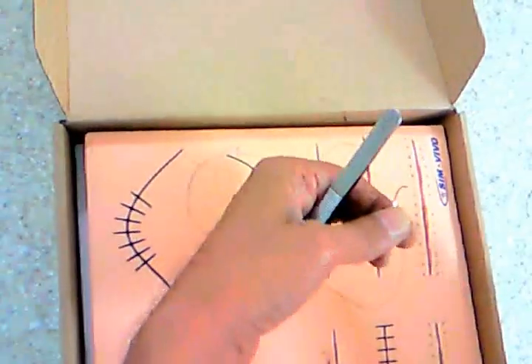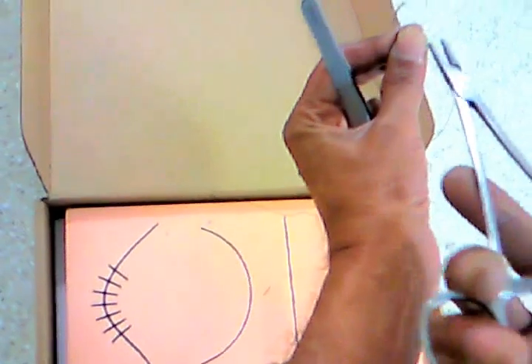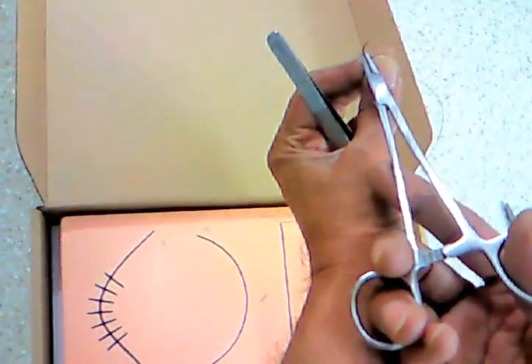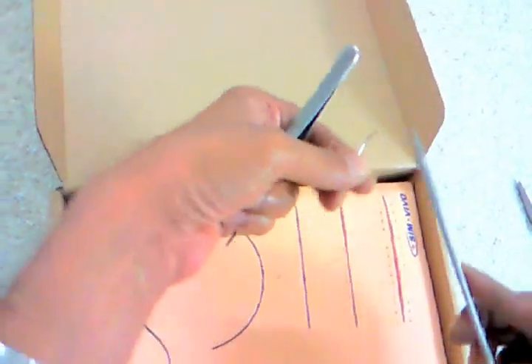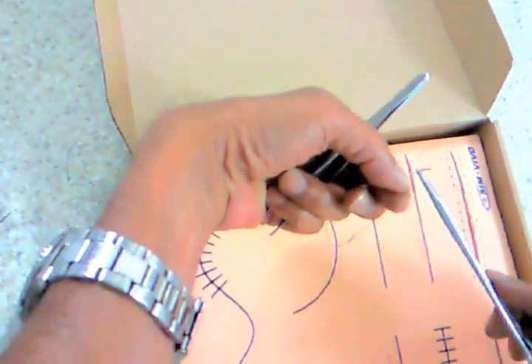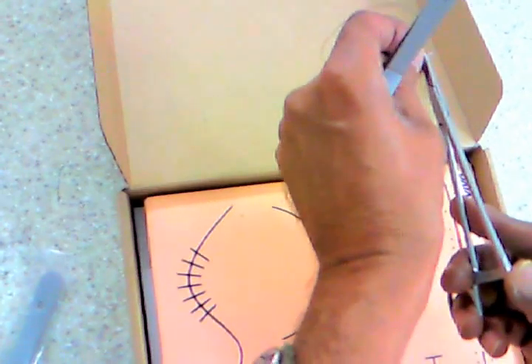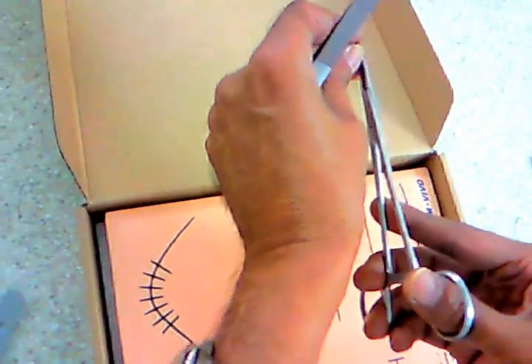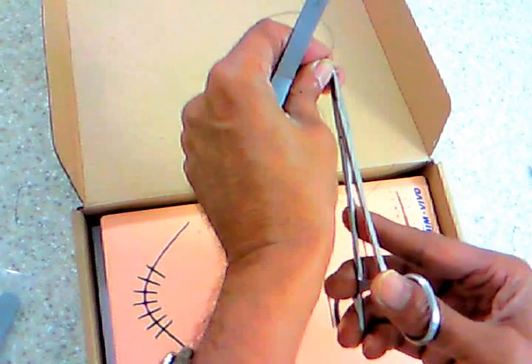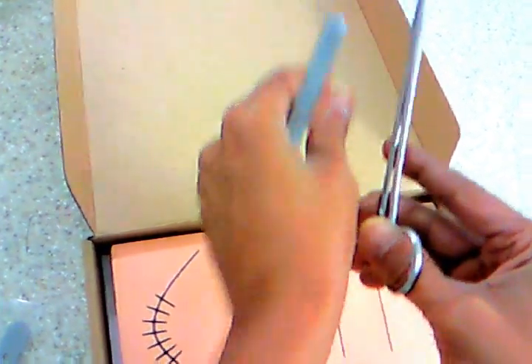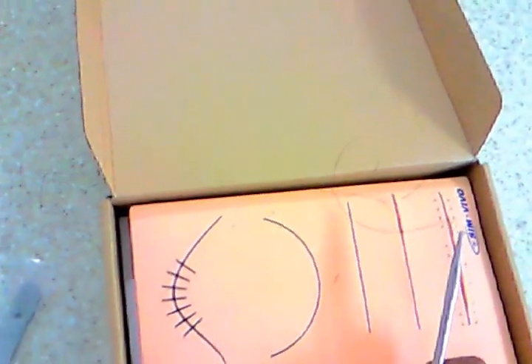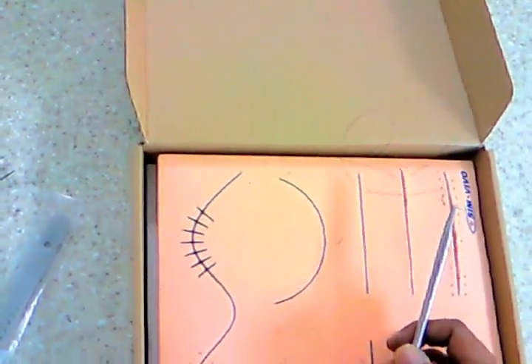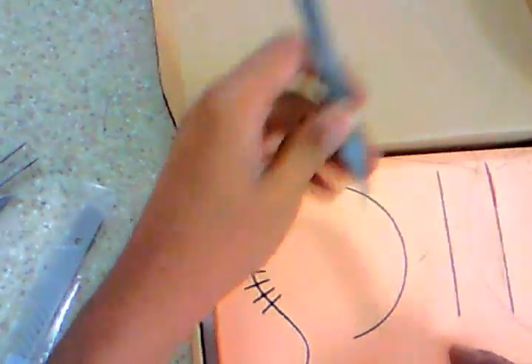Now watch very carefully. Previously, I had held my needle like this, the usual way I had taught you. Now I'm going to switch the direction of my needle. And I'm holding very close to the tip. Remember I told you there are certain situations when you do have to hold close to the tip, which is what we're doing now. Because I want to go exactly at the dermo-epidermal junction. That's going to be my next bite.